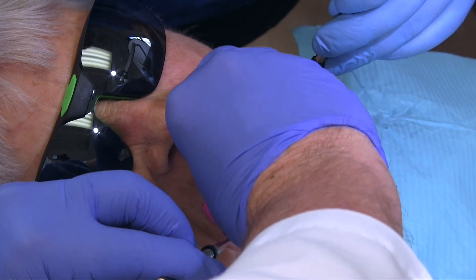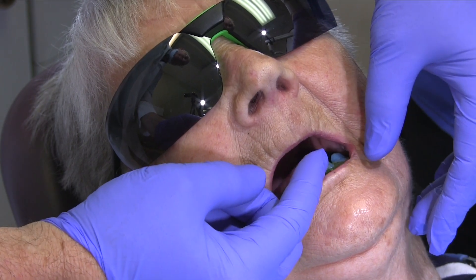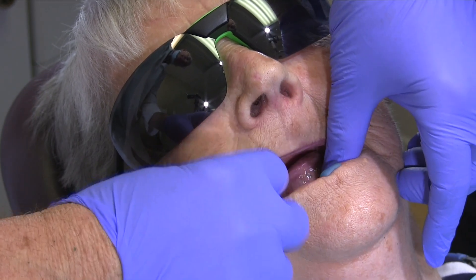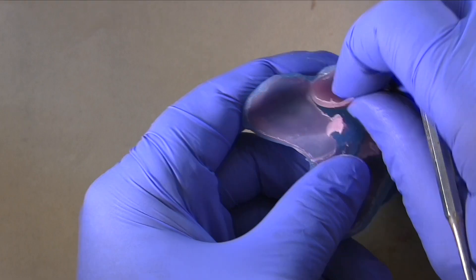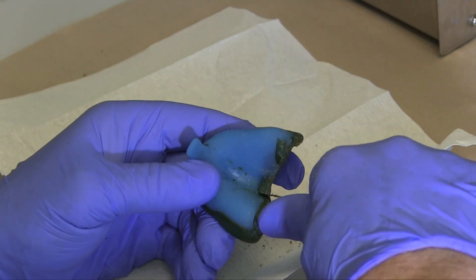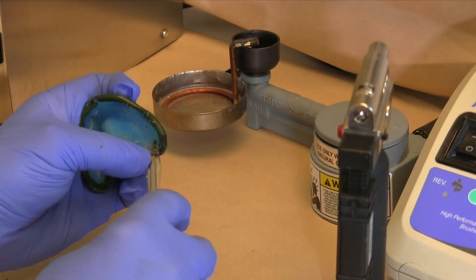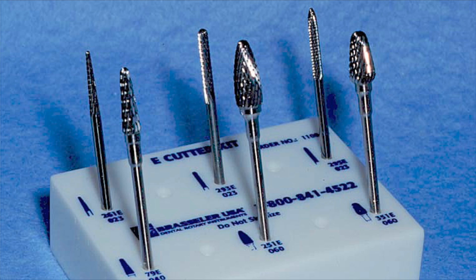I will demonstrate the technique for final complete denture impressions. Prior to final impressions, ensure that the custom tray with border moulding is properly extended. Prepare your custom tray by removing any wax spacer and smoothing any sharp edges or areas of excess that might distort tissues or be uncomfortable for your patient. Blend any internal edges of acrylic or border moulding that could distort tissues or cause discomfort if the tray is seated too firmly. Use acrylic burrs to adjust the tray if necessary.